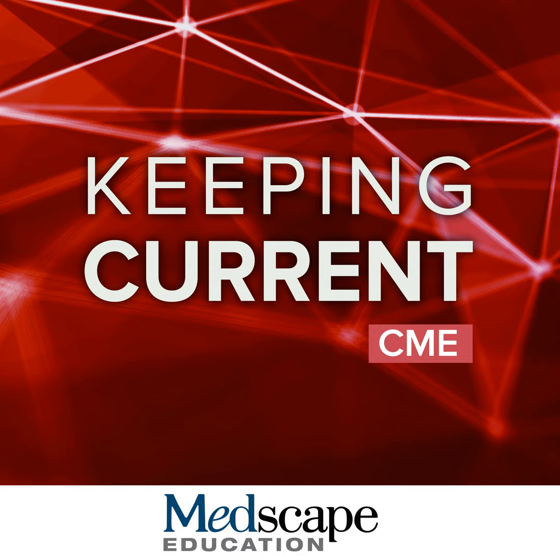And in general, again, it varies for each individual patient, but in general, for a number of patients with headache we will at first get just an MRI without contrast. It allows us to detect a number of abnormalities that can be associated with headaches. And when there are those red flags that I mentioned earlier, either from the clinical perspective or based on what we see on the non-contrast imaging, then we'll administer contrast to those patients. To mention one example, sometimes you have a headache because you have a brain tumor, and in that case, you'll need the contrast.